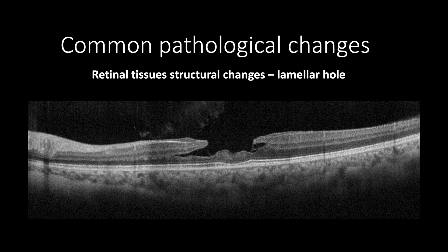The lamellar defect includes the outer nuclear layer with relatively intact ellipsoid zone and external limiting membrane, with the formation of a cleft between inner and outer retinal tissue along with cystic formation.